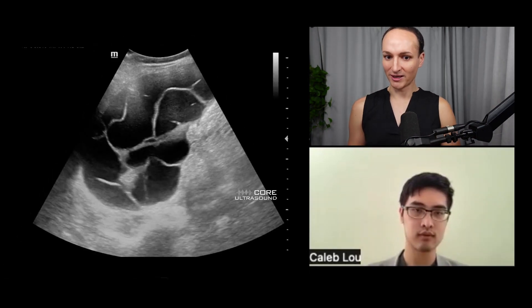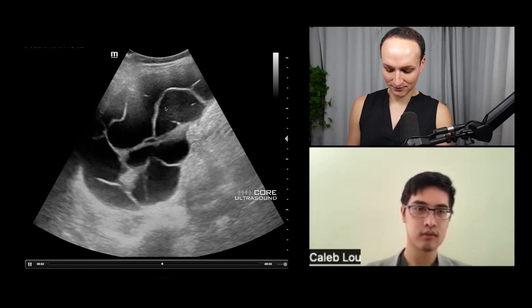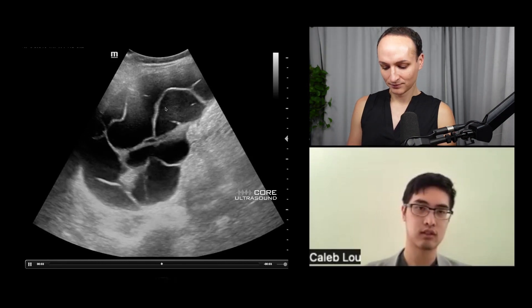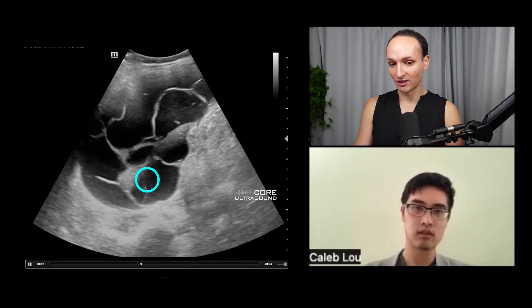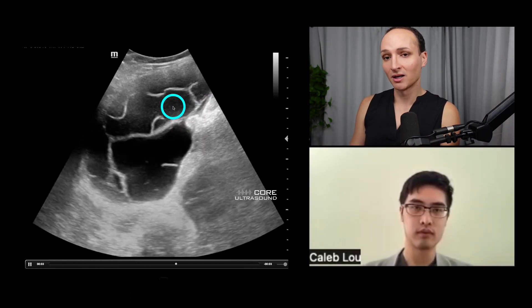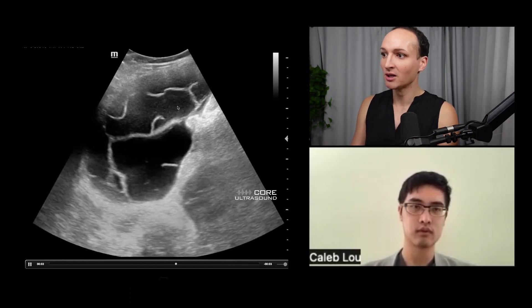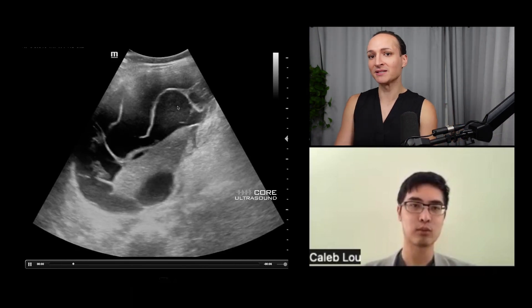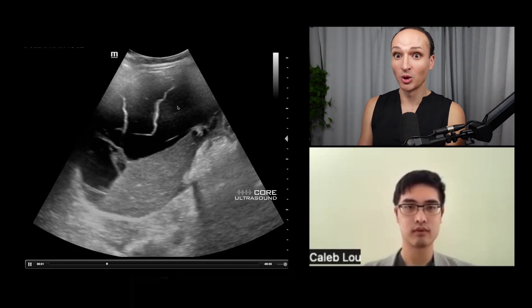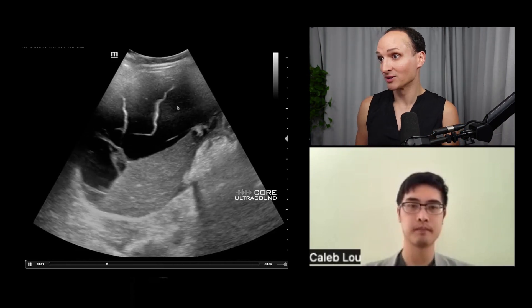This is a thoracic cavity — what are all these squiggly things? This is actually lung down here, and those squiggly things are basically fibrin strands, which you can see in the setting of a complicated pleural effusion, an empyema, or fibrosis from a chronic effusion. They look almost septated. I don't know the exact clinical story behind it, but if this patient came in super sick, this could definitely be an empyema because of the loculations.